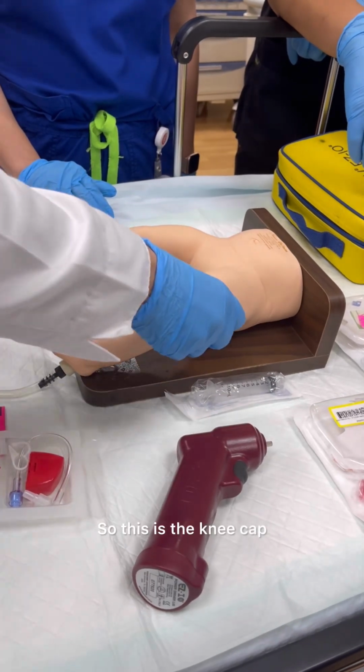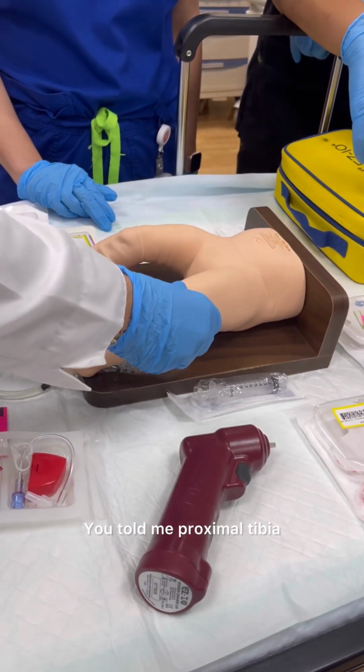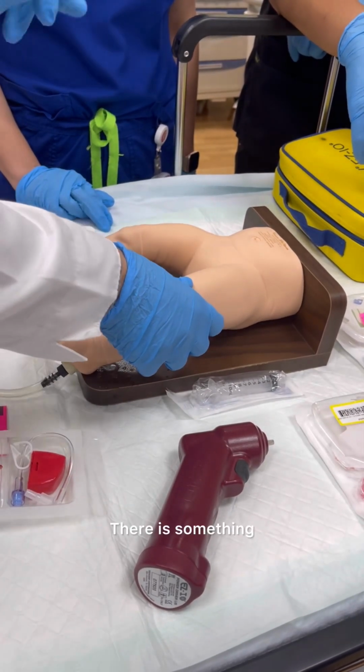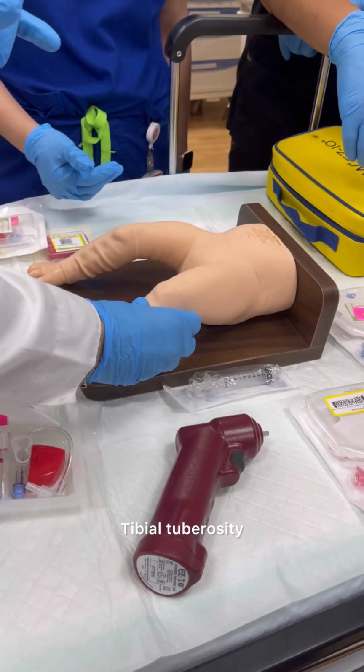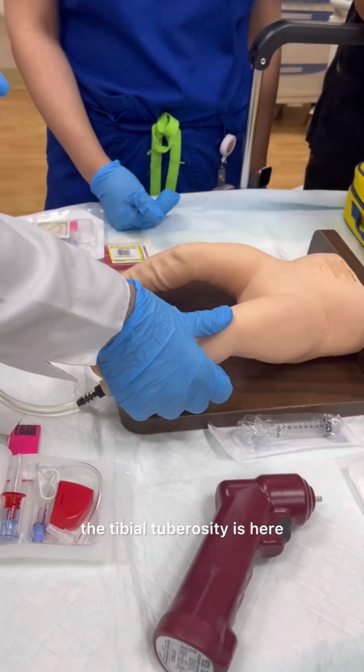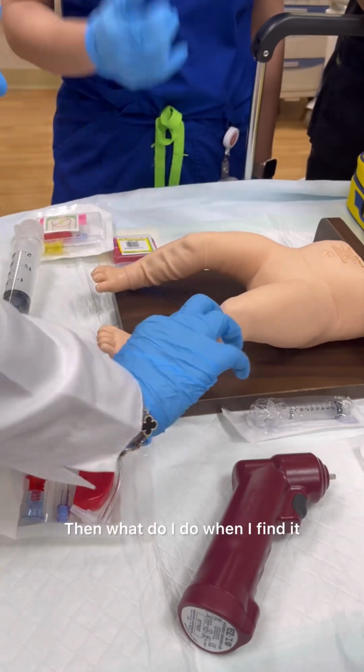So this is the knee cap. Here is the tibia. You told me proximal tibia, but where on the proximal tibia? Find me the landmark. What is the landmark of the proximal tibia? The tibial tuberosity. The first thing you need to tell me is to find the tibial tuberosity, which is here. Then what do I do when I find it?